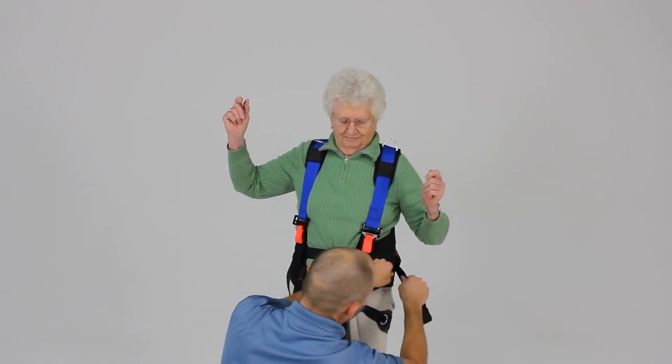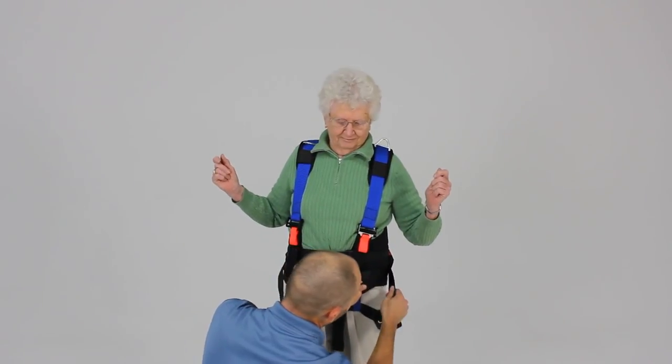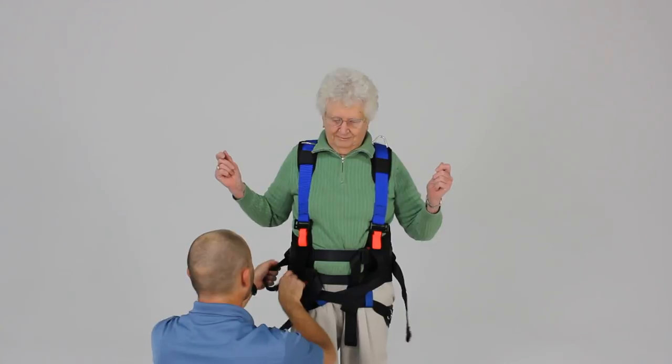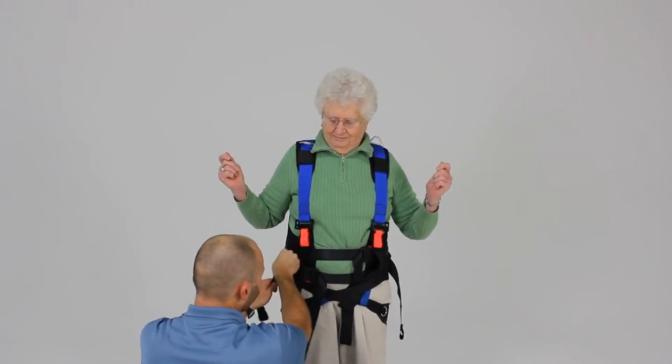In order to take up the slack, it's often easiest to grab the webbing and feed some webbing in as you tighten the buckle. Same on this side — feed the webbing in as you tighten the buckle.